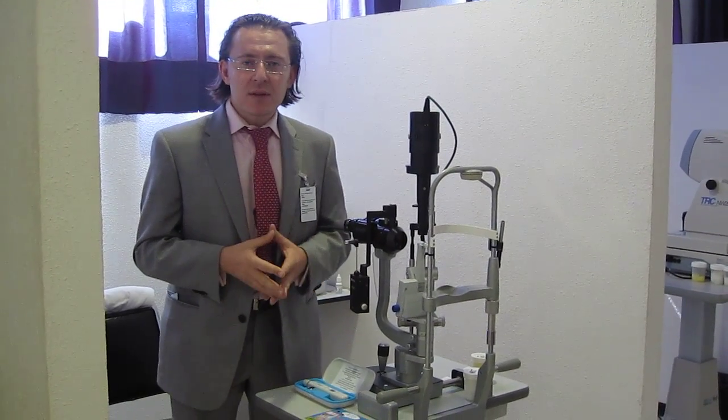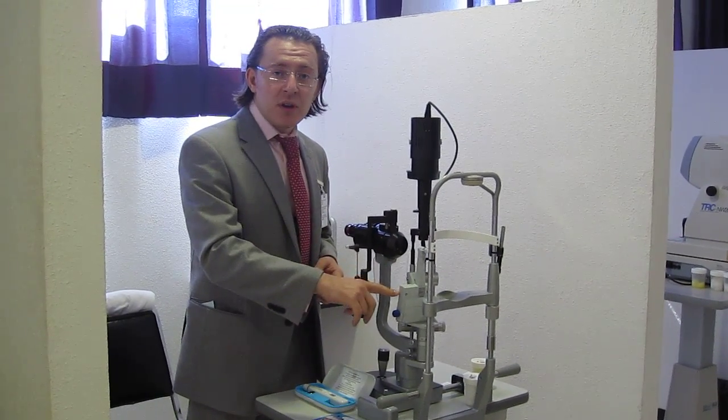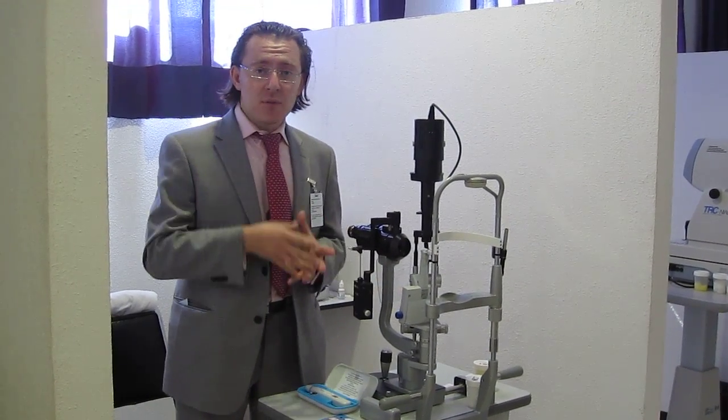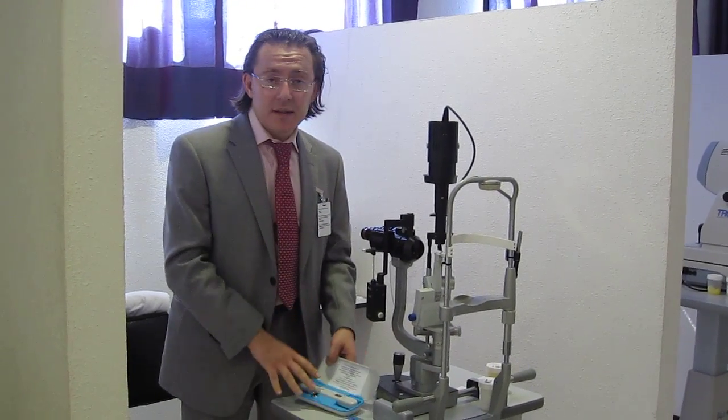Intraocular pressure measurement has become a standard procedure. We have a number of tonometry methods available: Goldmann tonometry, the Pascal tonometry, air puff tonometry, Tono-Pen, and newly to the market is Diaton tonometry.